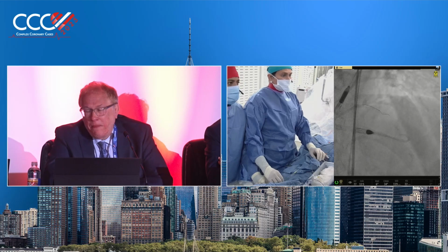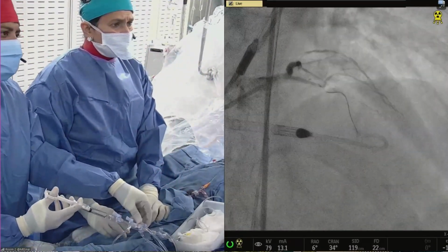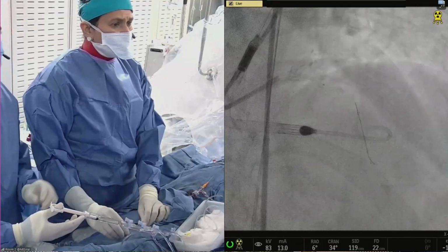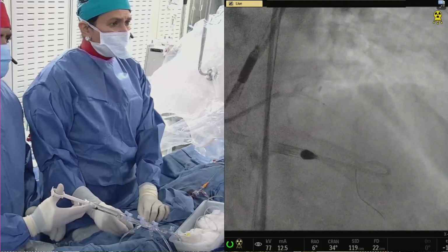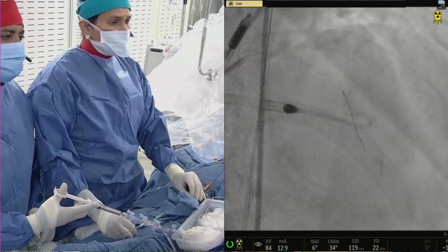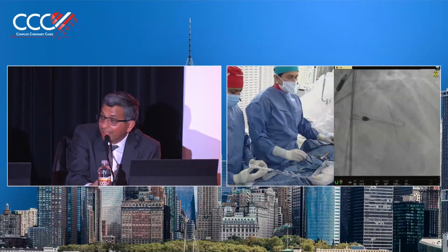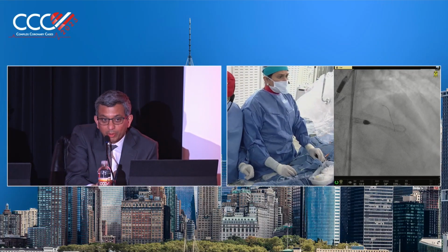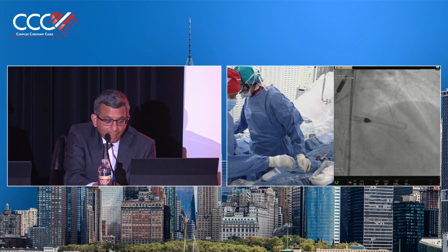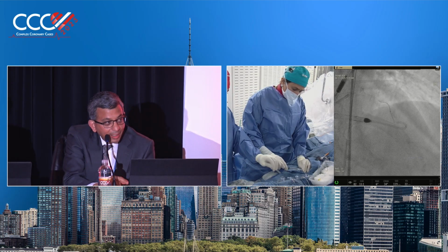Great. Samir Kapadia is in Cleveland Clinic. Would this patient be protected? Most of the time, again, it depends on the clinical situation. But if the LVEDP is 22 and the patient is not having heart failure symptoms, and the fact that this is almost a total LAD, some people would say that this is possible to do if the RCA and circumflex are revascularized without protection. So it is, I think, a clinical decision more so than an anatomical decision at this point.